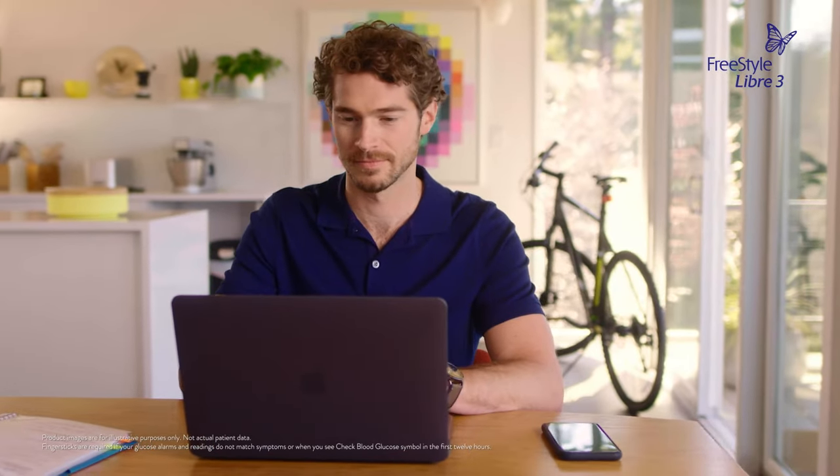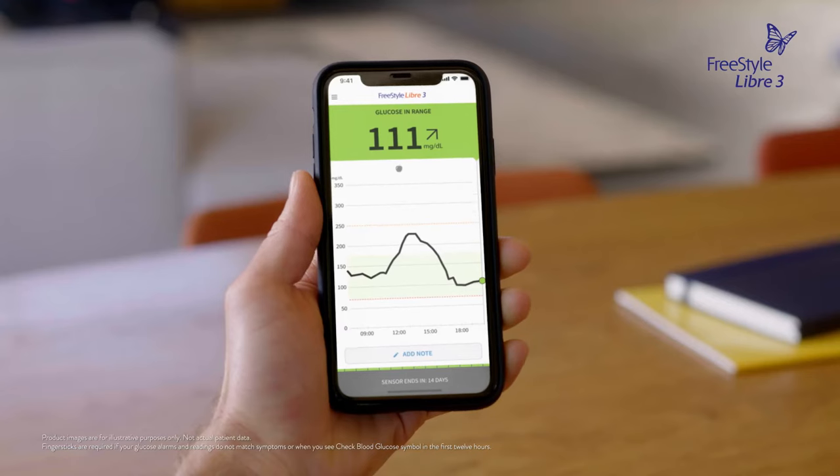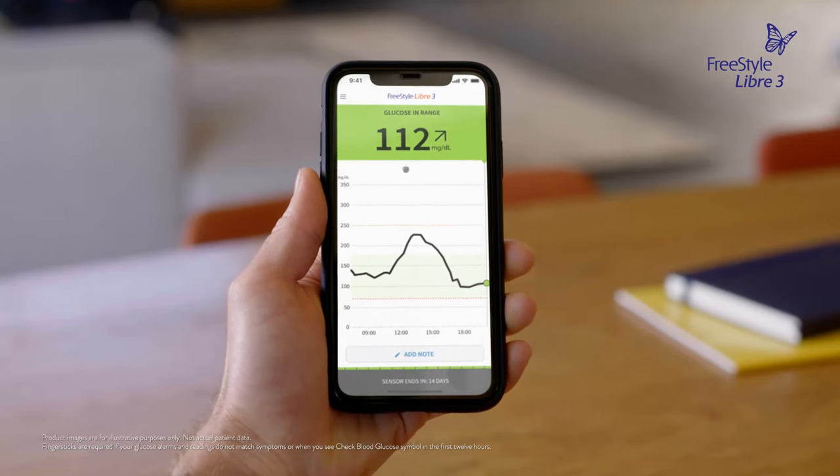Knowing my glucose is now as easy as glancing at my phone, because the sensor sends glucose readings every minute directly to my smartphone. So I can act faster to avoid a low glucose.